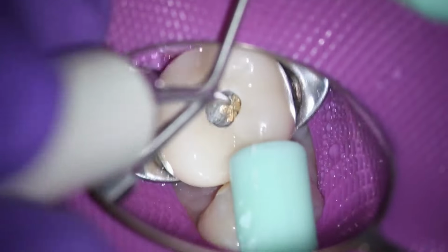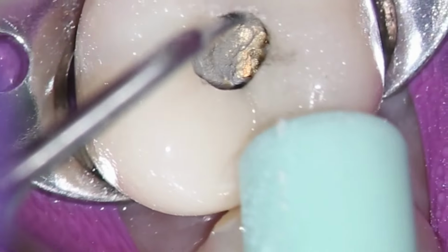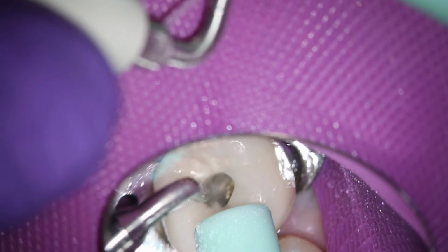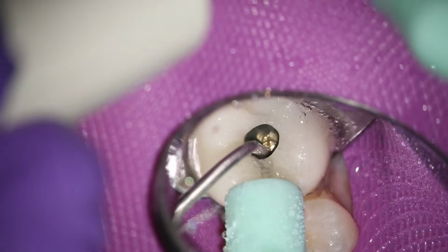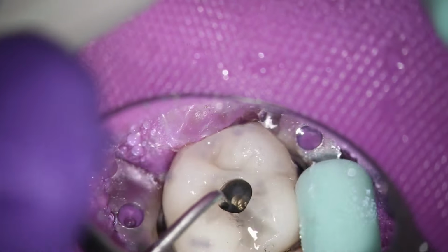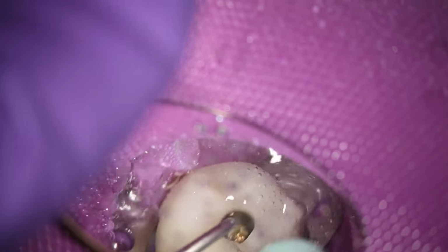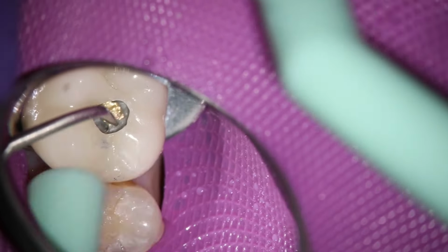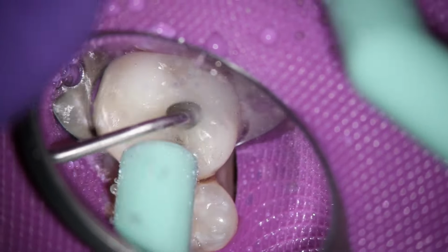And here we use an ultrasonic tip, and we go around, remove the composite from around the post. Do it very accurately. Sometimes we do this wet, sometimes we do it dry. And again, Joy isn't keeping my mirror clean here because I've moved it away. And her being at the scope, she can position that suction just ideally. And we go ahead and remove the rest of the composite around the post, and then we remove the post.